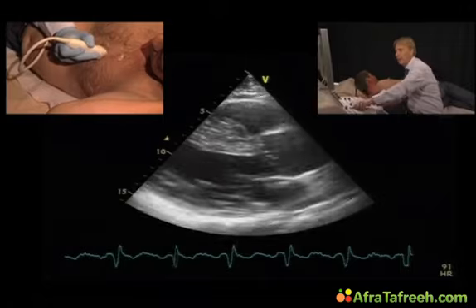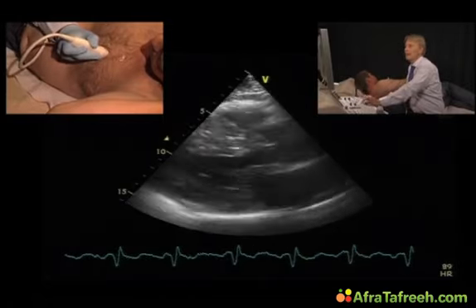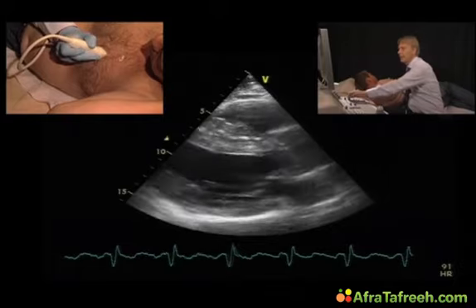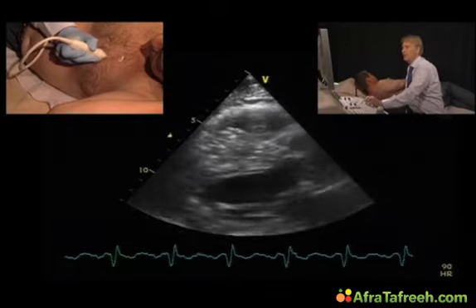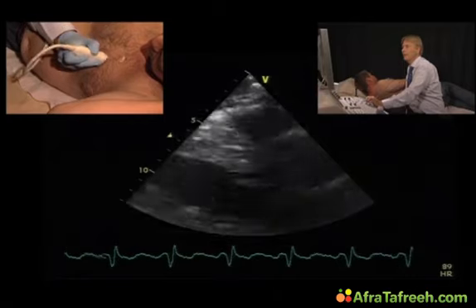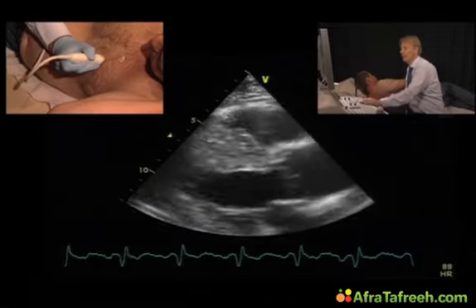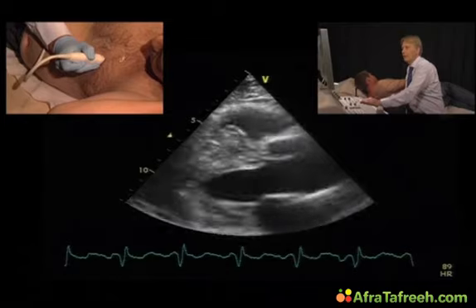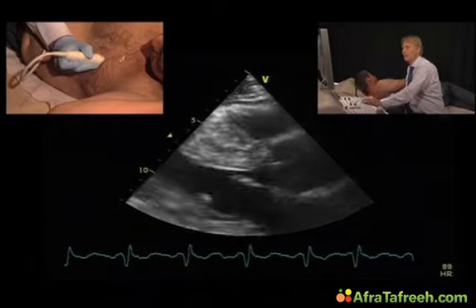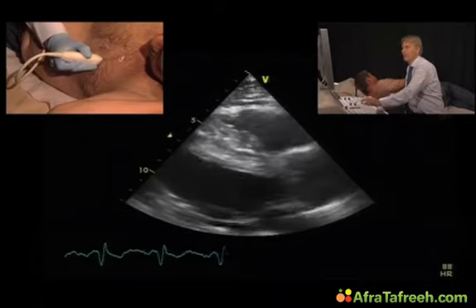From the parasternal long axis view, it's quite apparent that there is massive left ventricular hypertrophy. But what is also clearly visible is that the patient has a very strongly speckled appearance of the interventricular septum. This is an atypical view just to cut through the myocardium, and you can see that you have a lot of echo-dense speckles here. This is caused by the fiber disarray. So this fits quite nicely to hypertrophic cardiomyopathy.